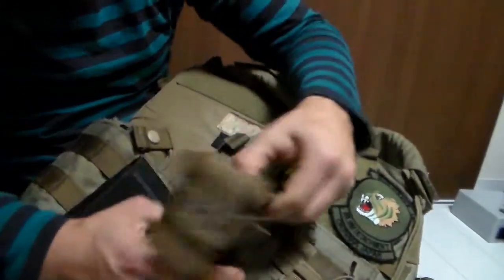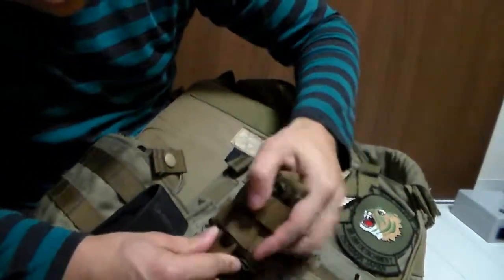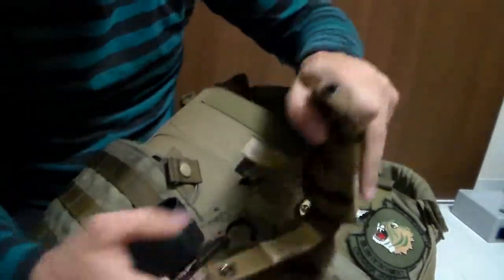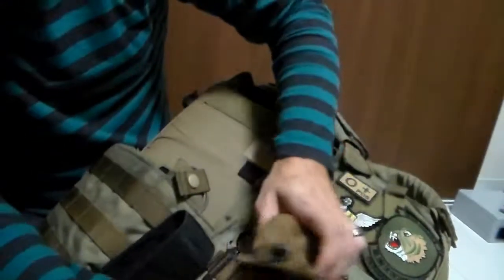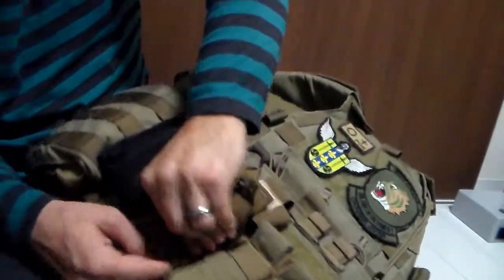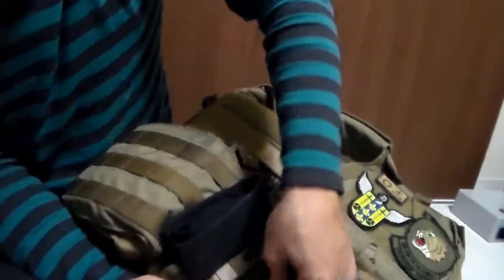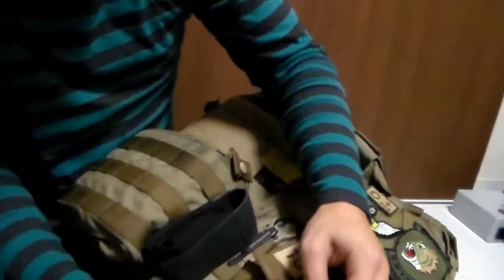As with most MOLLE things, you'll slide it through one, then the other. I had this a bit lower — it's the thing closer to the mags. I already have my MP5 mags hanging pretty low. It works — staying it one lower. Clip it like so.